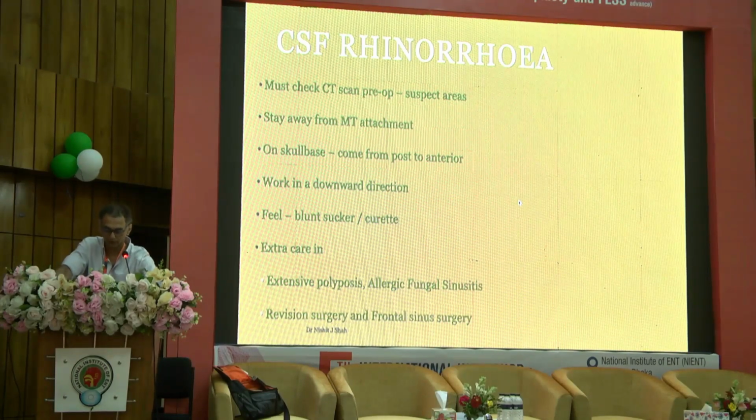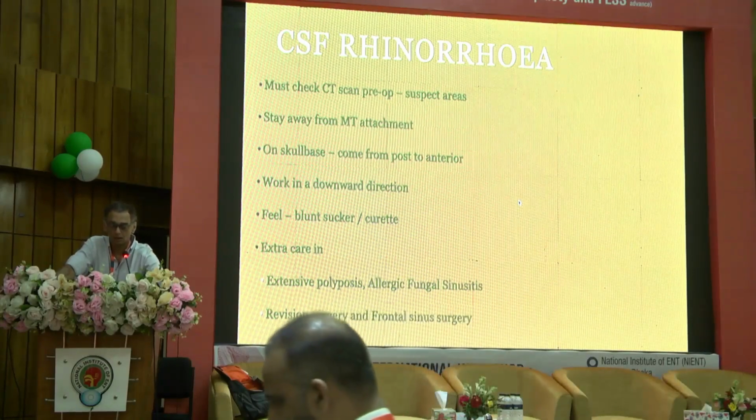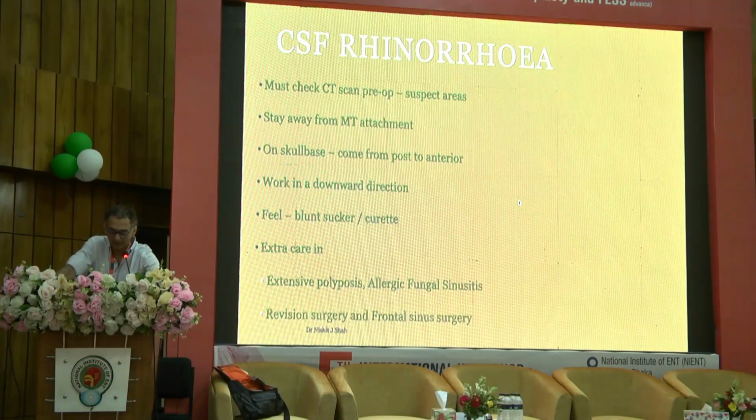Don't use sharp instruments, don't use sharp curettes on the skull base. Use a ring curette, use a broader curette or a blunt suction to feel the skull base. In situations where you can have skull base or bone erosion, such as extensive polyposis, allergic fungus, tumors, you need to have more care, and especially in revision surgery.